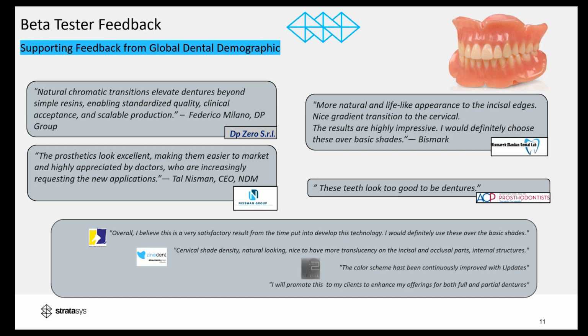So I found changing to TrueVoxel is a very easy procedure. I think the results that we're getting are tremendous. Our doctors seem to like them quite a bit more than the original basic shades. And it also gives us a little bit better opportunity to try to match the natural teeth that we have in the mouth for our partial dentures. I think the enhancement to these denture teeth really gives us an upper hand in trying to match the aesthetics of what the patients currently have in their mouth.